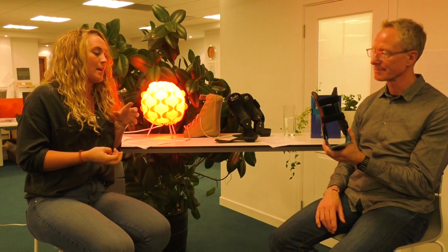Yeah, always. I just find for tolerance and things, the heel lift does help. We know that in some situations, a tight gastroc may compensate at the midfoot, which can cause rubbing along the MLA. And I just find by adding a heel lift, it may reduce some of that rubbing.